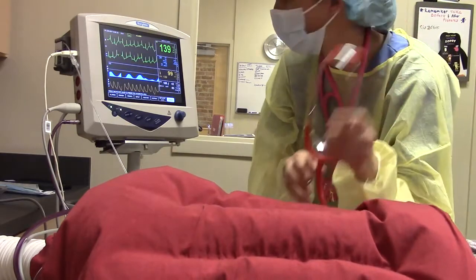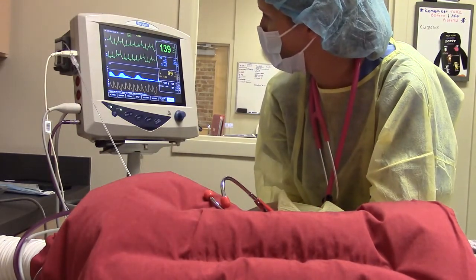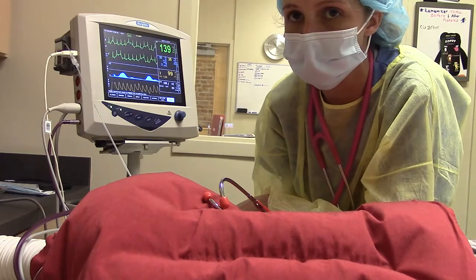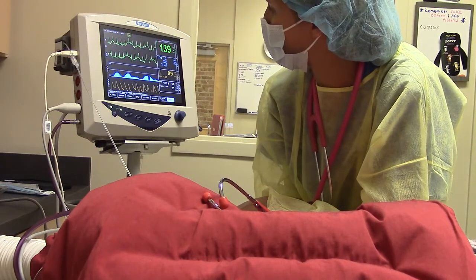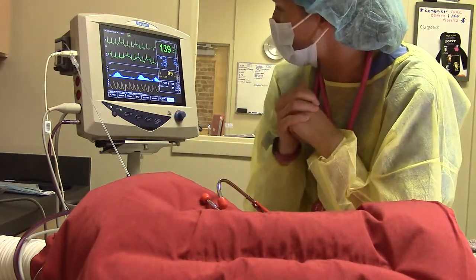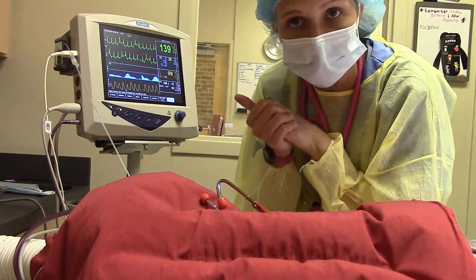Everything looks great. Still no need to get Dr. Bowling for anything concerning. ECG is looking beautiful. Our inspired CO2 was a little bit high, so we increased the flow rate — that pushes CO2 out of the system and prevents the patient from re-breathing it. It's decreased since then. Otherwise everything looks great and we'll keep monitoring.